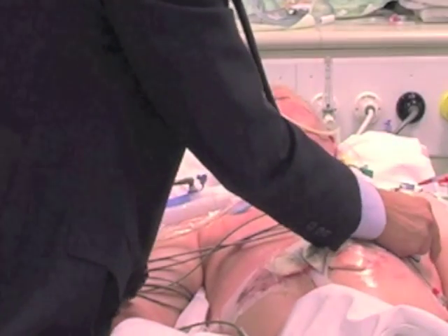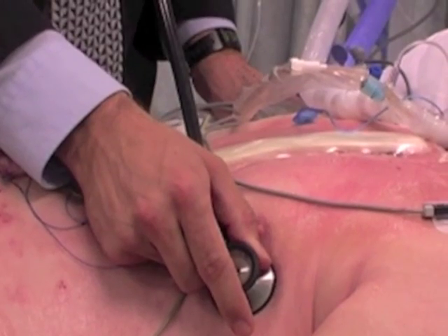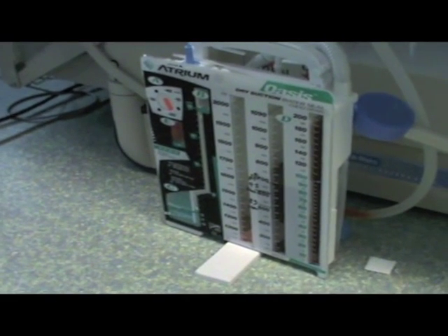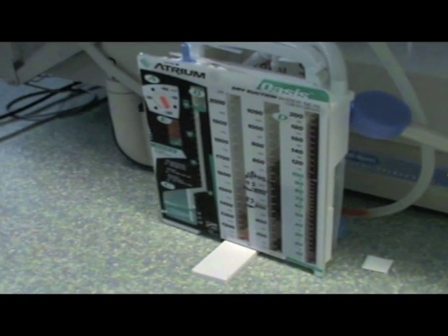Listen carefully to the chest so that you have a baseline. Again, check the X-ray. If there is an intercostal tube in situ, do you know how to deal with it?